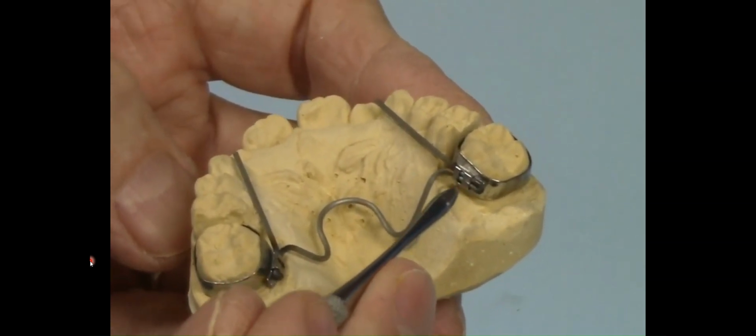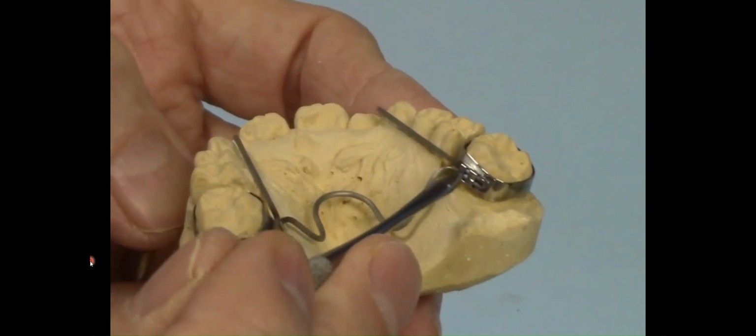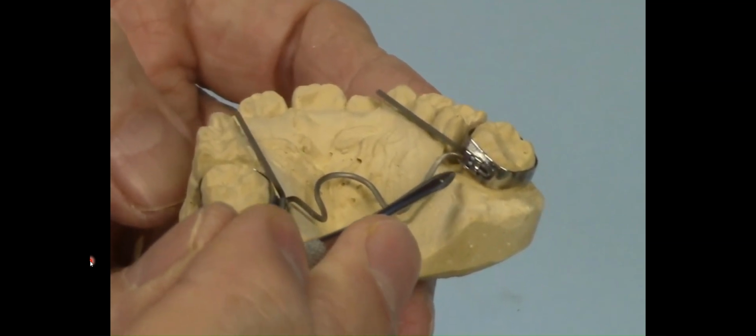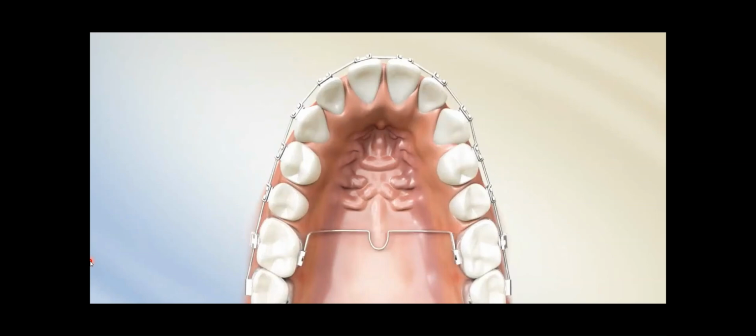This video shows the use of a lingual sheath to hold the arch wire of the transpalatal arch appliance. Here we can see the action of the transpalatal arch.